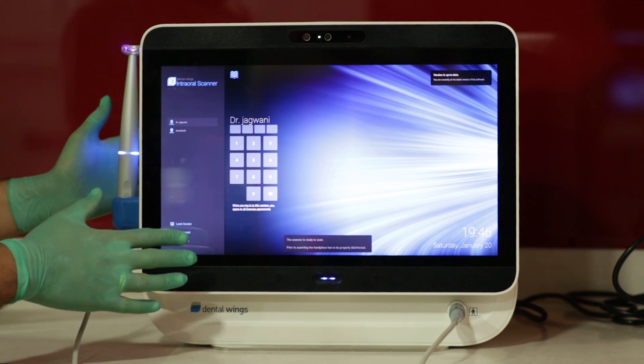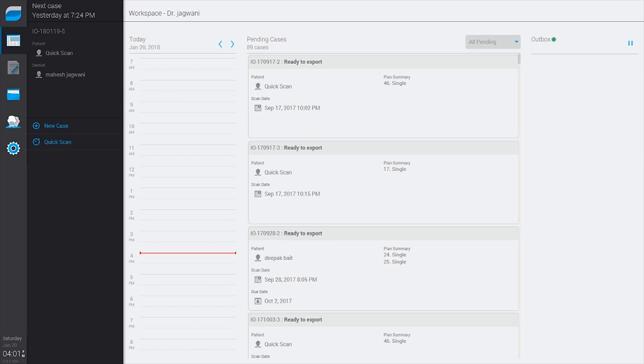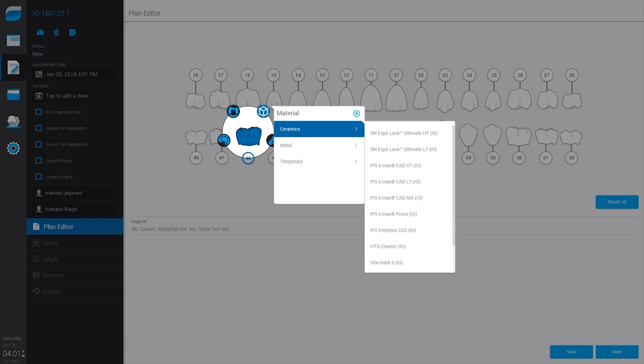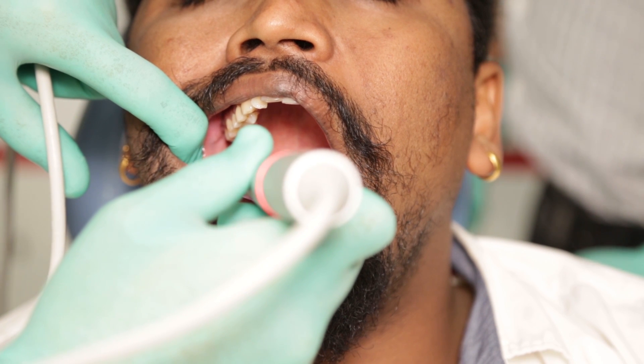This is how it works: you just log in with your login ID, create a patient's file, enter all the details, and enter the scanning mode — it's that simple. On this page you will see two modes available. If you sign up for the powder version, you will not be able to access the powder-free mode at all. I have a patient ready on the chair whom I'm going to scan.